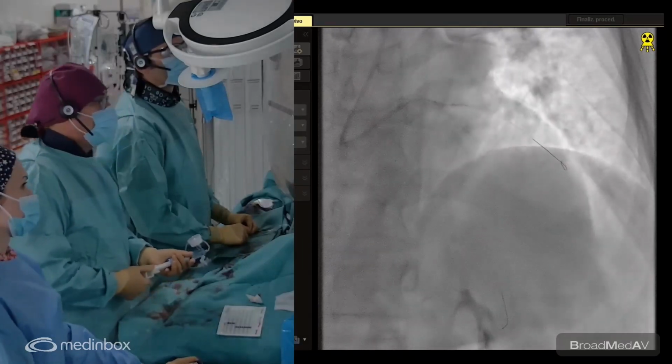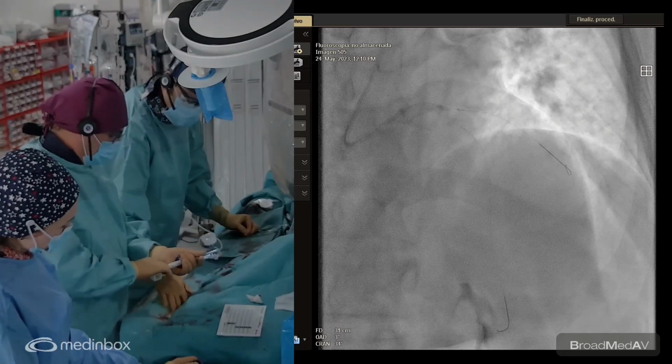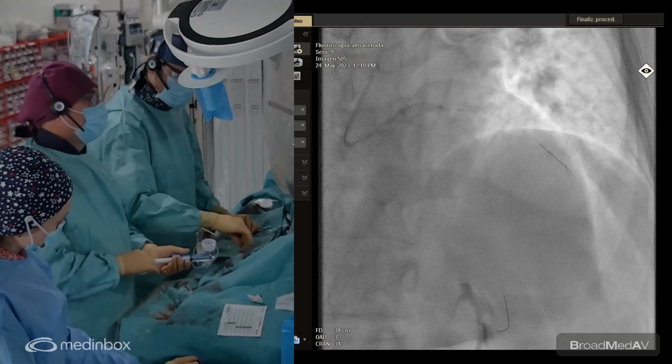the thick and medial calcified plaques. 12. Okay, I think it's enough.